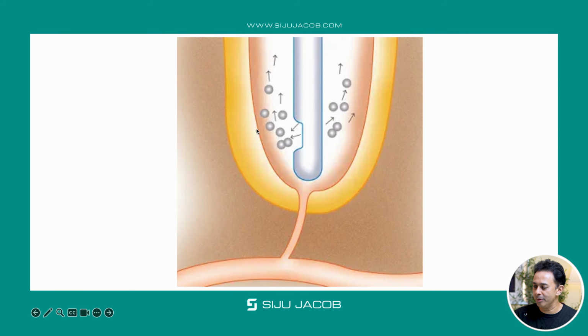And there is a very easy way to solve this. All you need to do is not jam the needle into the canal space. So when one puts the needle into the canal, always try and retract it. And if there is resistance to retraction, then don't inject the solution. Retract it, and the needle should fit loosely in the canal like this. It should not be contacting the walls of the canal or be tightly fit. And if you do that, then you minimize chances of extrusion.